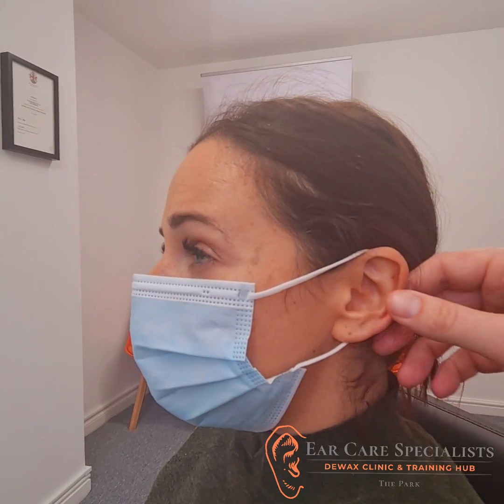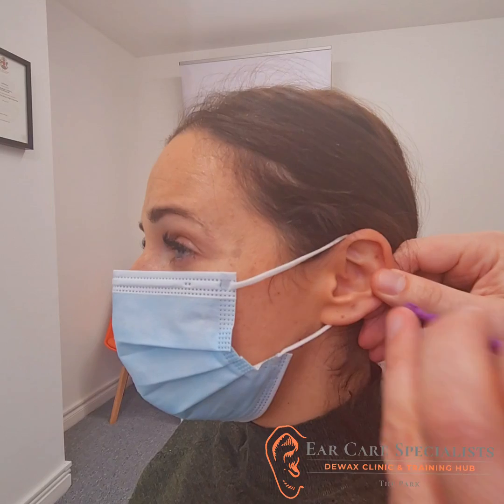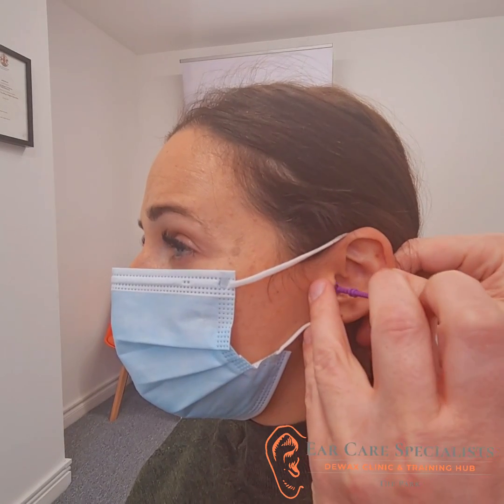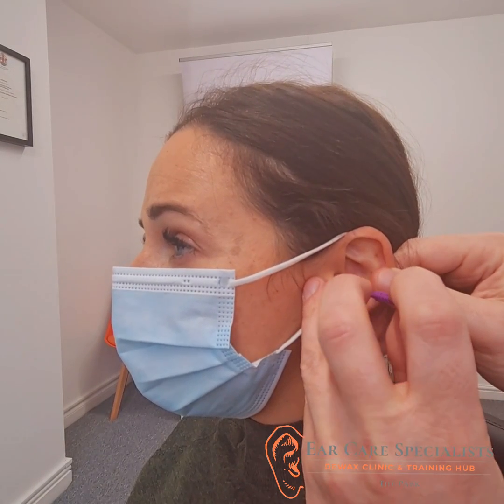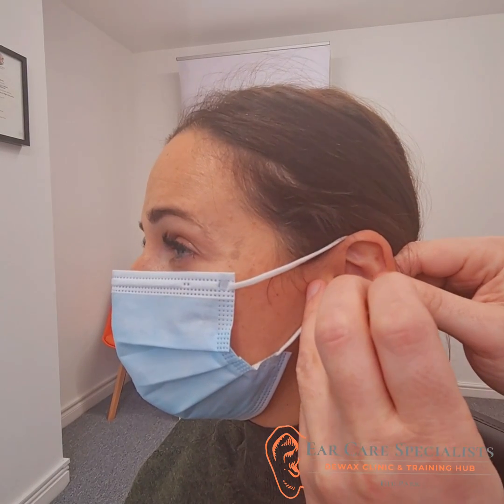I'm just going to straighten up your ear a little bit by pulling on it. I'm just going to pop it carefully in. That's it. I'm just going to start turning it, very gently.